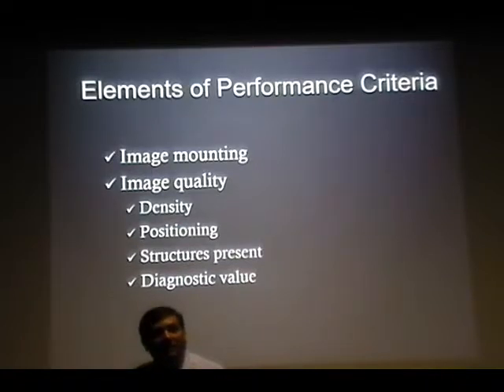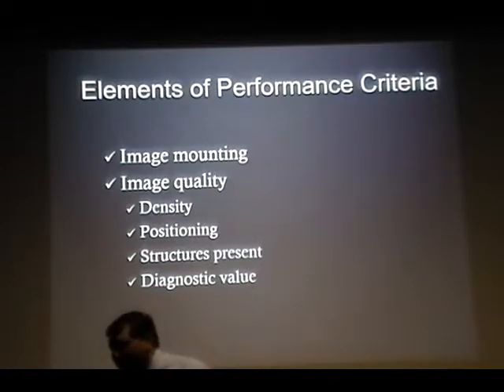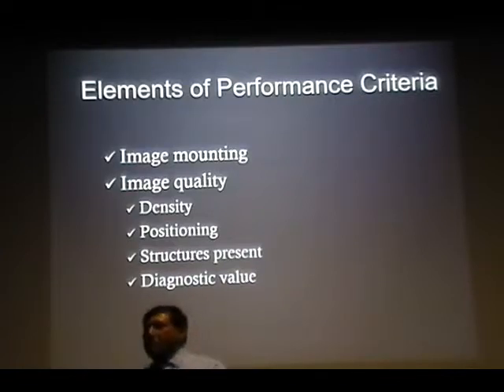Well, then what example could I use? Those who are using Apple, they say retina display, super retina display, all those things. Basically what they're doing is putting more and more pixels so that you can get more colors. Similar in dentistry, when I say contrast, we are talking about a gray color. As we move along the course, you'll understand what I mean by gray colors.